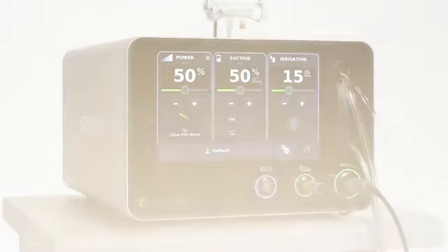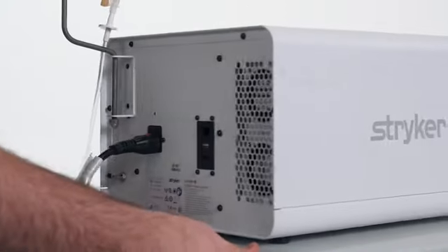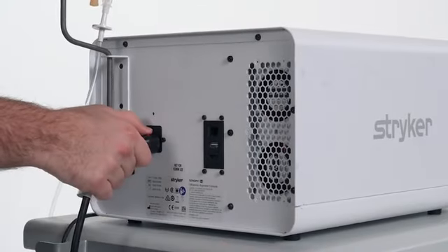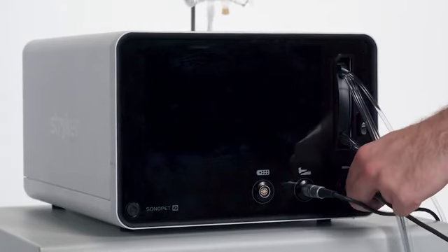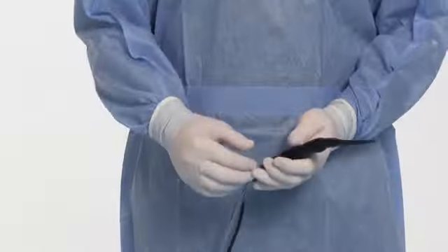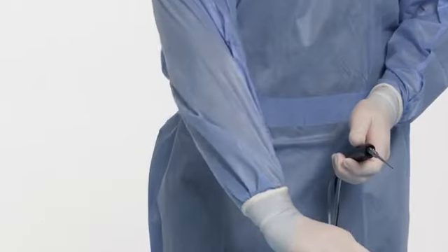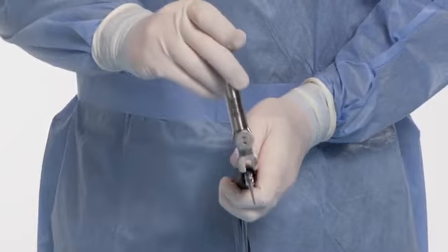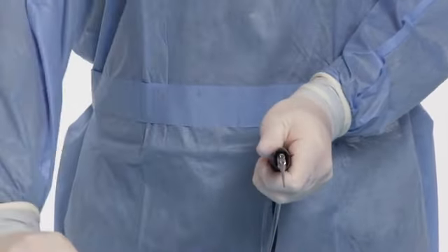To disassemble the Sonopet IQ after the case, press the power button to turn off the system. Disconnect the power cord from the console. Disconnect the handpiece from the console. Remove the irrigation sleeve from the handpiece and dispose into an appropriate container. Using the torque wrench, loosen the tip on the handpiece in the opposite direction of the arrow icon.